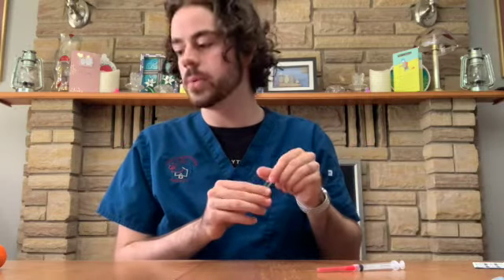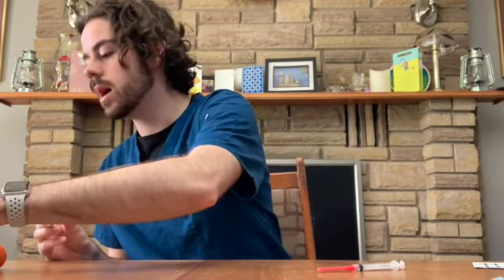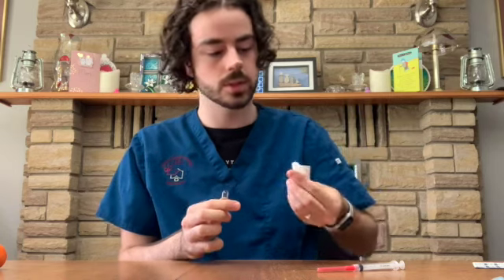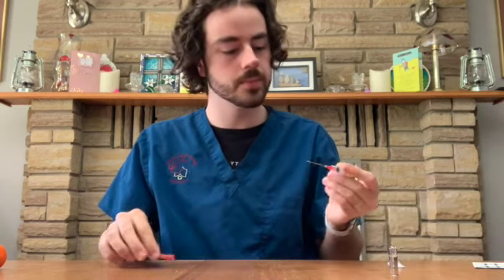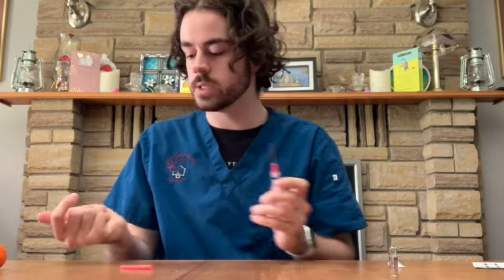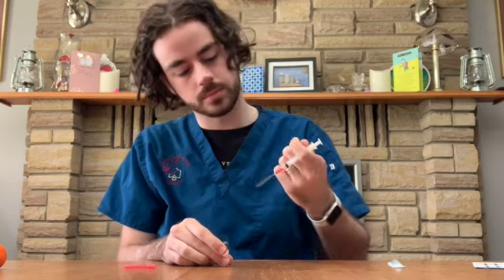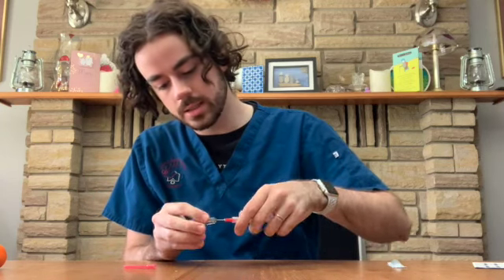And then for my ampule here, I'm going to ensure that all the medication is in the bottom. I'm going to take a piece of gauze, wrap it around, and break the ampule away from me. Just like that, perfect. Now I can draw up my medication. I don't have to inject air into this one because it is an open system. There is no top on it. So I'm just going to be careful not to touch the sides.